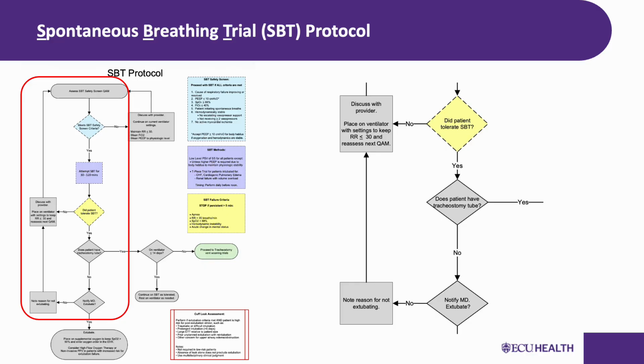If the patient passed the SBT but is not quite ready for extubation for other clinical reasons, document that as well. The team needs to know that the patient passed the breathing trial but is being held for a specific reason. That way the issue can be addressed and the extubation can happen as soon as safely possible. The bottom line, passing an SBT should create momentum toward extubation. Every hour a patient stays intubated after passing an SBT is an hour of unnecessary risk unless there is a documented clinical reason to wait.